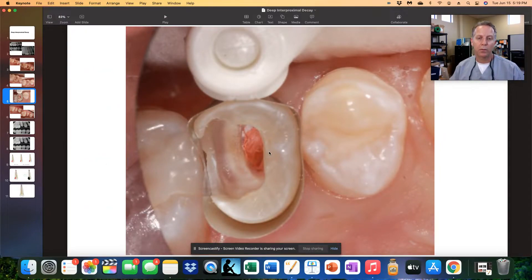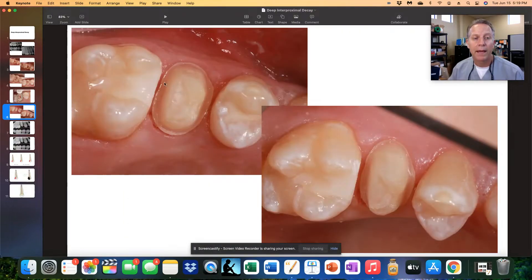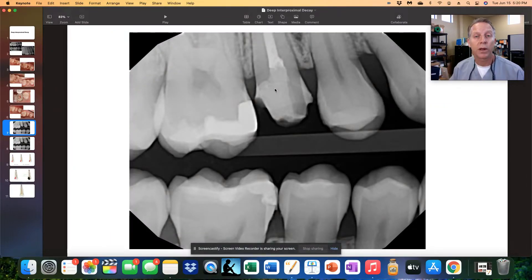When it was done, got the root canal finished, put a matrix band around it, filled it up, and did my prep. Now you can see that is all enamel right there. It did not have to bury this margin on the crown very deep subgingivally. We were able to get a very predictable impression — or I think maybe we did a scan on this one. Here's how it turned out: that little triangle is enamel, so now the crown is sitting on enamel and it's not having to be buried deep inside the tooth or underneath the gum line.